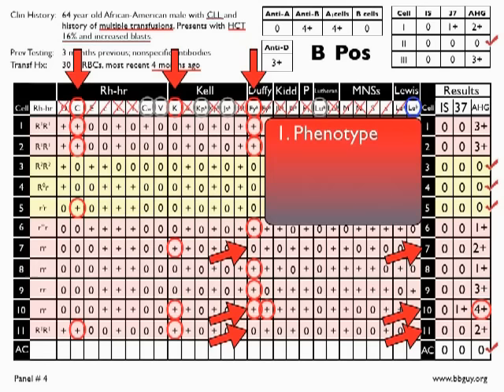So some of the things that you can do, you can do phenotyping, certainly, and you probably would do phenotyping to kind of get an idea of which ones of these might be the target. That may or may not help. You can and should consider the use of select cells, but I want to take you through how you would use enzymes in a case like this.